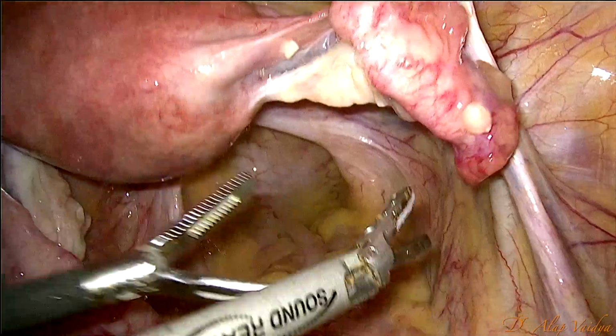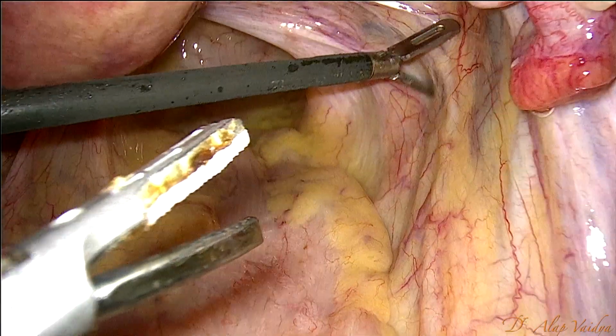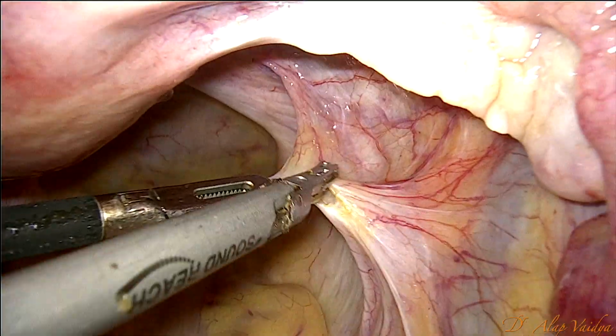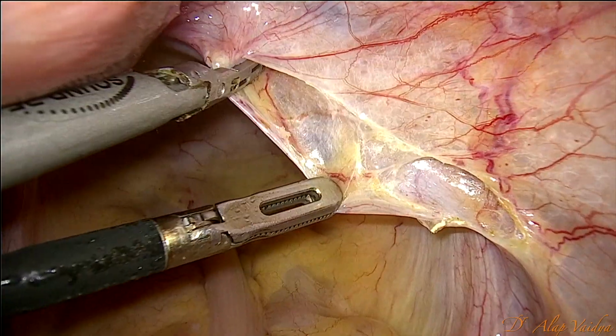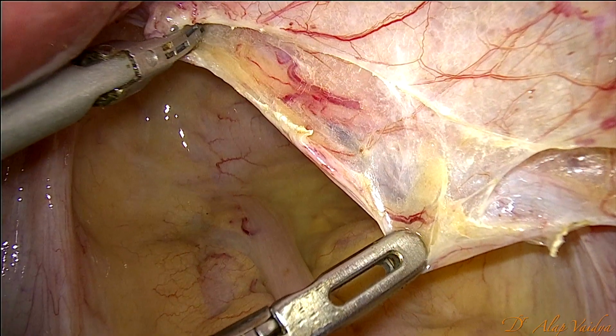So now we are being medial to the IPL ligament. This approach is also called the endometriosis approach because it is used in endometriosis surgery mostly. So you pick up the peritoneum just above the ureter, start cutting. In case of TLH you can go up till the uterosacral if you want.